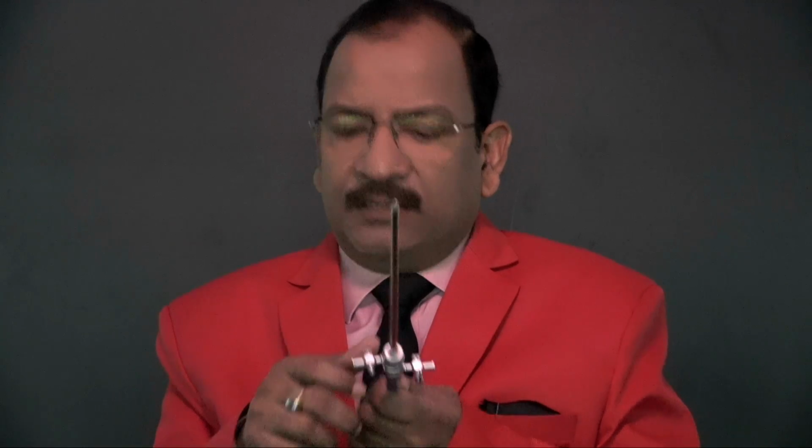Pardon? No, the arrow mark is not always there. If it is there, it's good. Otherwise, towards you is irrigation, and away from you is output, that is the suction. Remember, some people say up and down. No up and down. I can put both up and I can put both down. So it is not that. Away from you is going away, that means exit. And towards you is entry. So this is input, this is output.